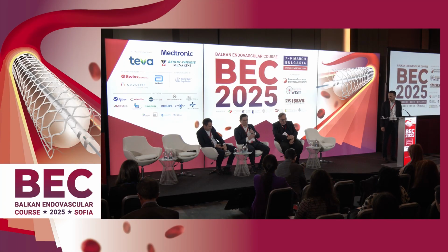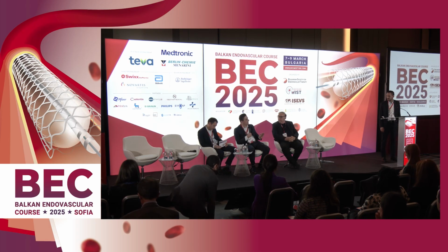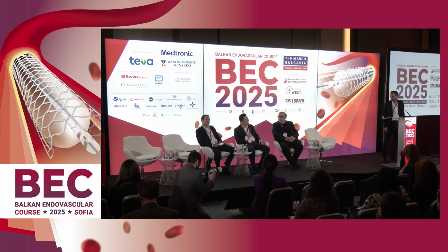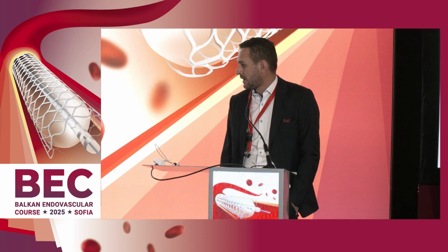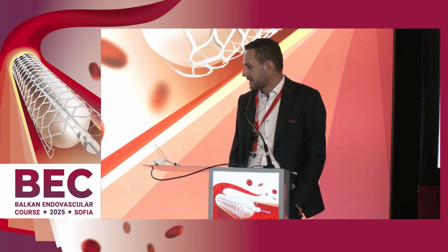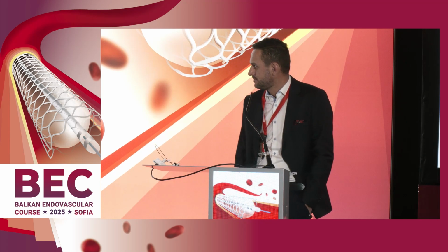Congrats for this. My question is: is it only angiographic targeting of the vessel, or do you use ultrasound? Only angio for the puncture. Only. Okay. And for the primary access? When the patient has calcium, we use the calcium for the visualization of the artery.